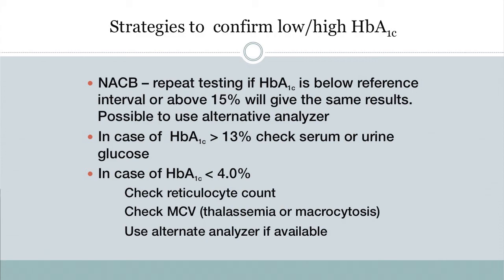Here is a strategy for handling abnormal A1c results. When we see a high A1c, is it real? When we see a low A1c, is it real? The National Academy of Clinical Biochemistry suggests repeating the test if the A1c is below the reference interval or above 15%. However, if you use the same method again, all you've done is confirm your method's consistency. In our laboratory, when the hemoglobin A1c is greater than 13%, we check whether a serum or urine glucose result is available. If both serum glucose and A1c are high, we have concordance; if the serum glucose is high and A1c is low, we have discordance that needs to be resolved.